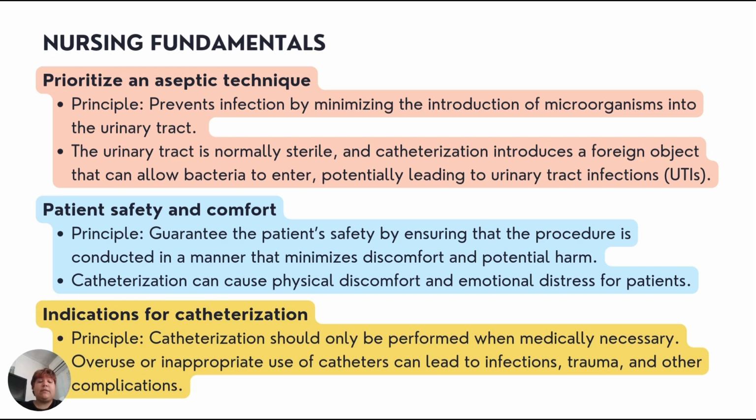Indications for catheterization. The principle is that catheterization should only be performed when medically necessary. Overuse or inappropriate use of catheters can lead to infections, trauma, and other complications.